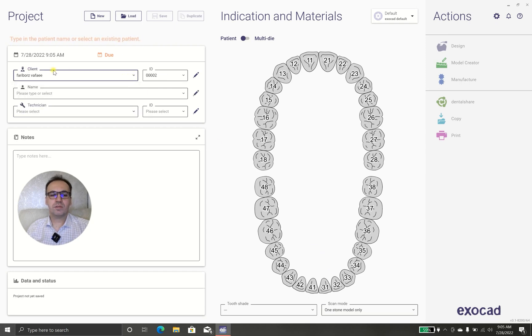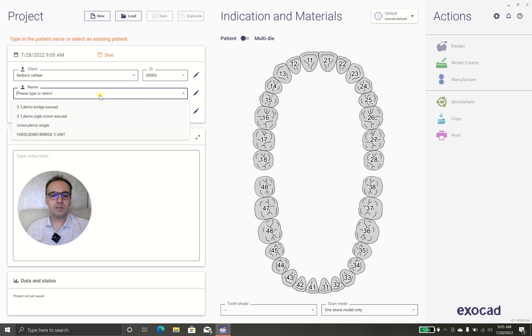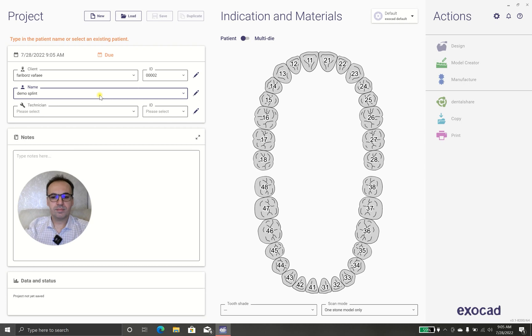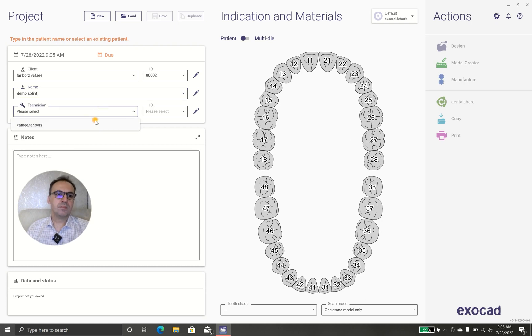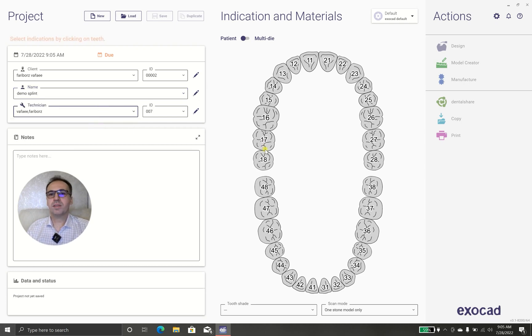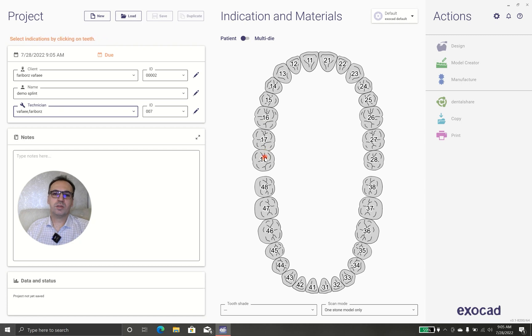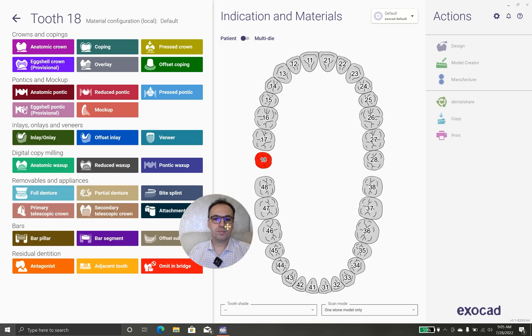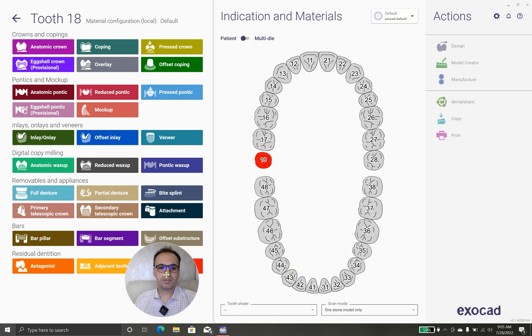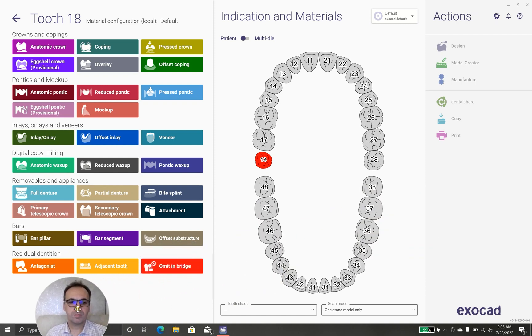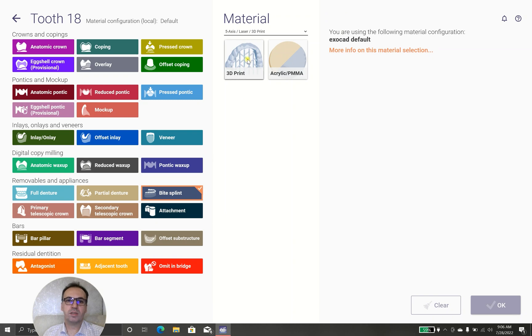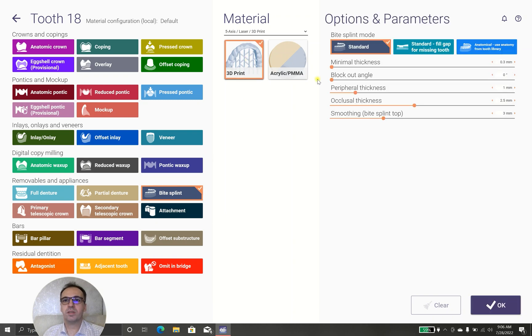First, we choose the client, demo, splint technician, myself, and then we are going to choose the jaw that is going to be designed for the splint. I designed the splint on the upper jaw, so I choose the upper jaw and I'm choosing bite splint and I'm going to 3D print it.